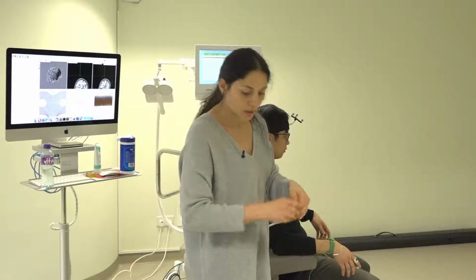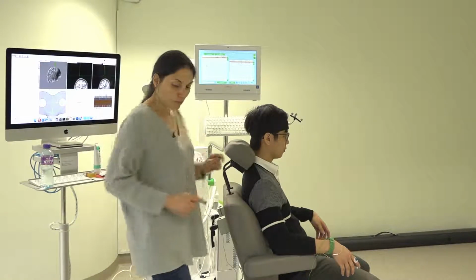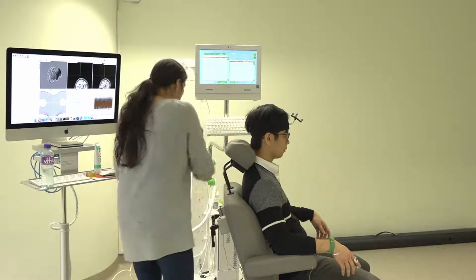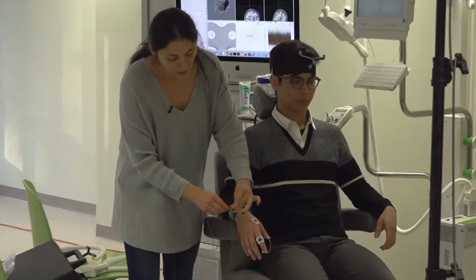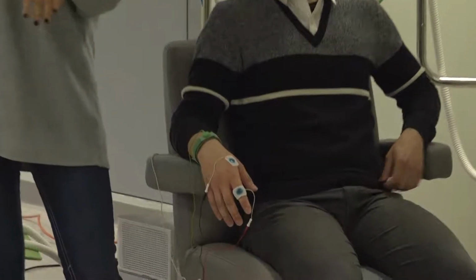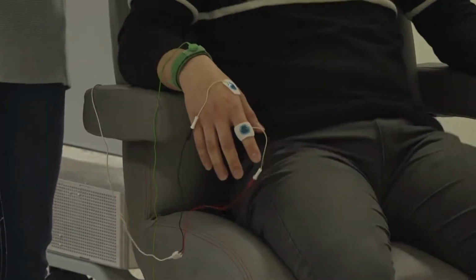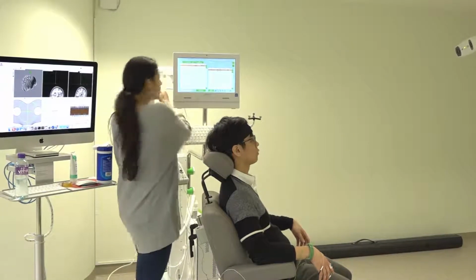Sometimes I put tape, depending on the electrodes, just to have a very good contact, okay? Black in the active, red in the reference. If you make an error, you will have the MEP just opposite. No problem, just change the cables. I think this is right, but if we are wrong, we just change the cables, no problem. Okay. This is the first part.